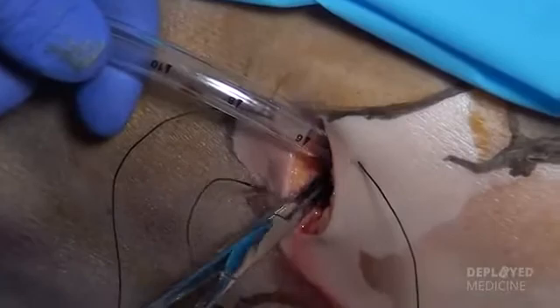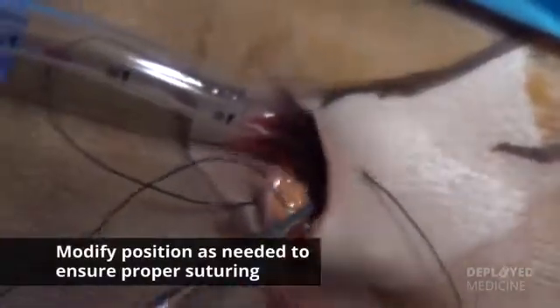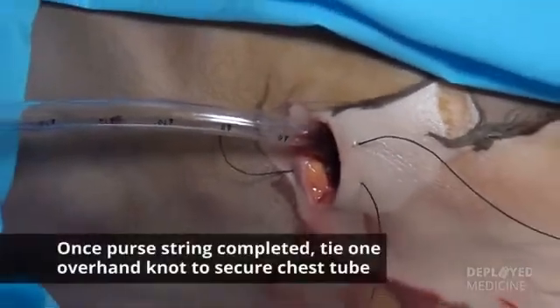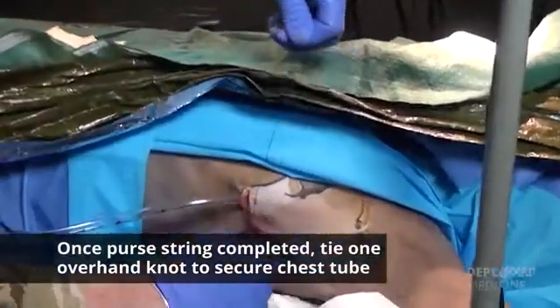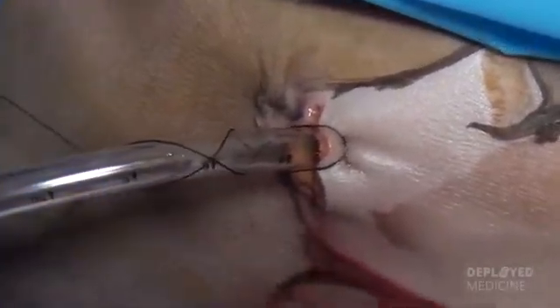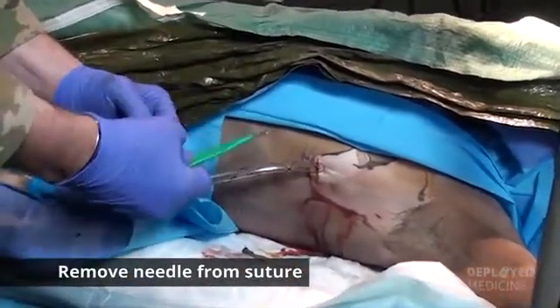Somewhat of a difficult position. Just modify what you need to do to ensure that you're getting a good suture in there. Once you have your purse string done, throw one overhand knot. And you're going to go back and forth up your chest tube. At any point in time, if you're done suturing, you can remove your needle.